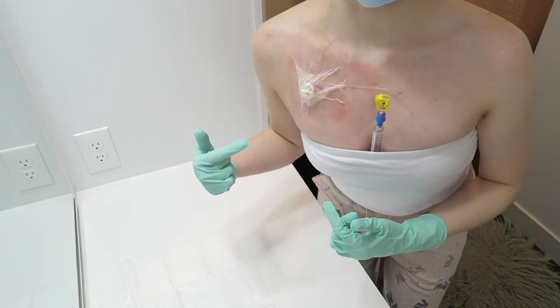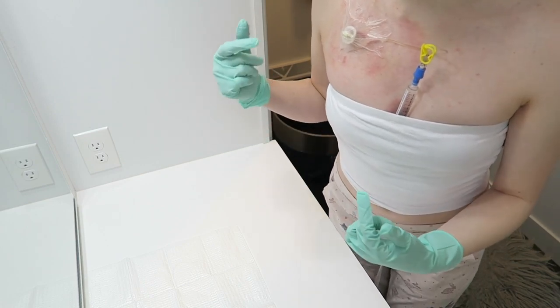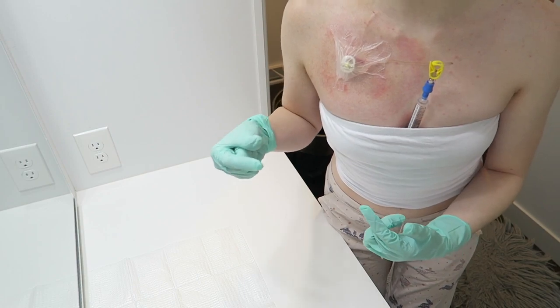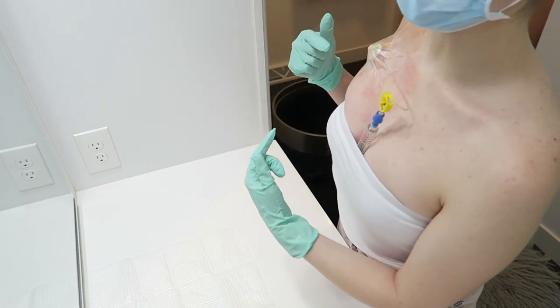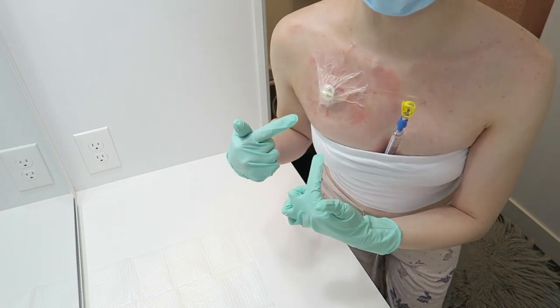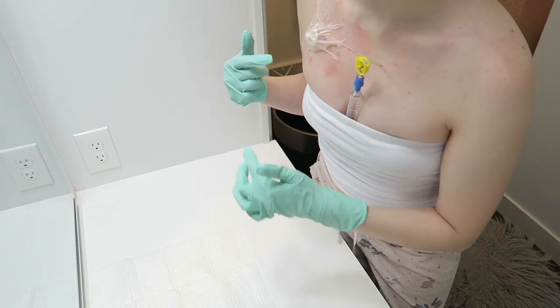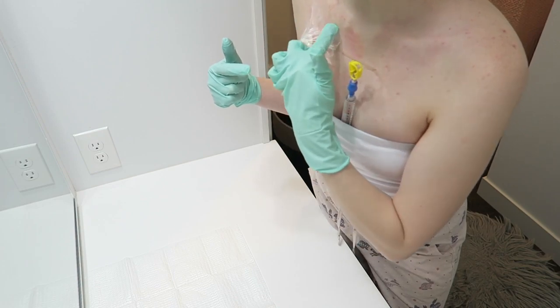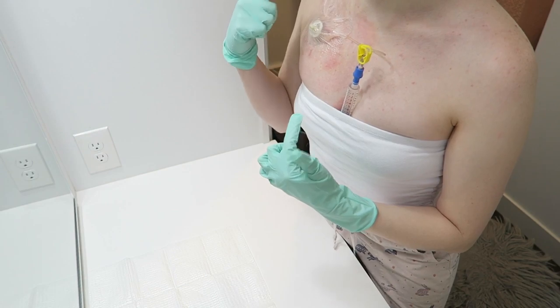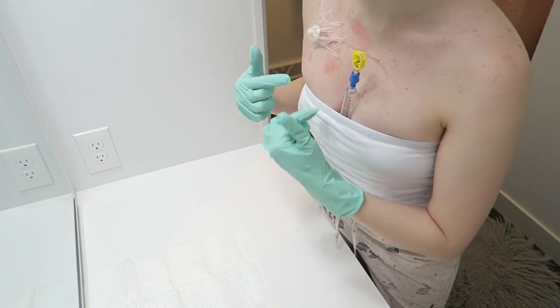So now you can kind of see my issue I have with my particular port. My port sticks out quite far from my body, and then the needle itself sticks out quite far. That creates this tenting issue, which is why one bandage does not cover my entire thing. Technically, yes, it all is pressed down, but it is very close on these lower and upper edges, so that's why I put another one the opposite direction.